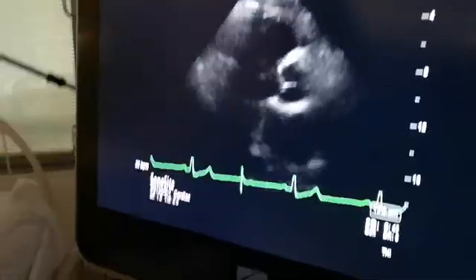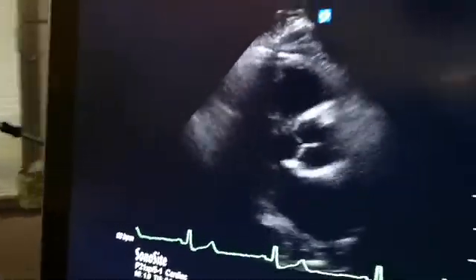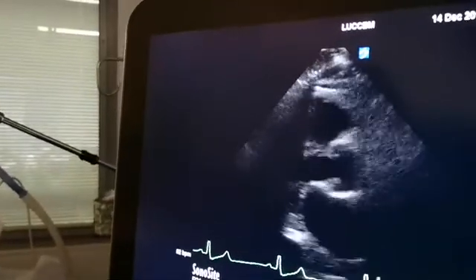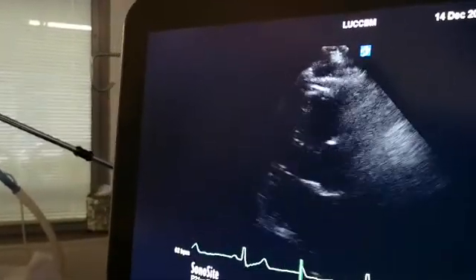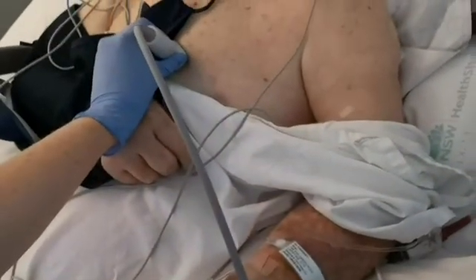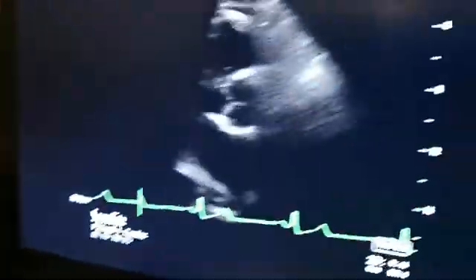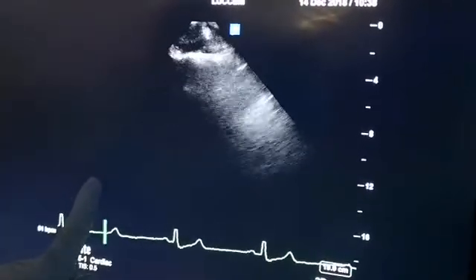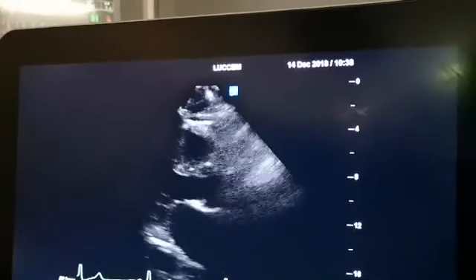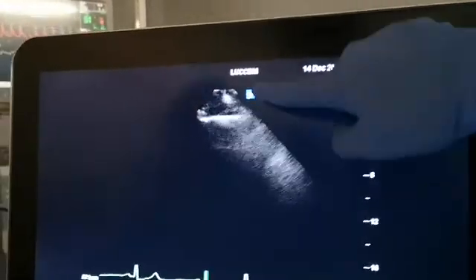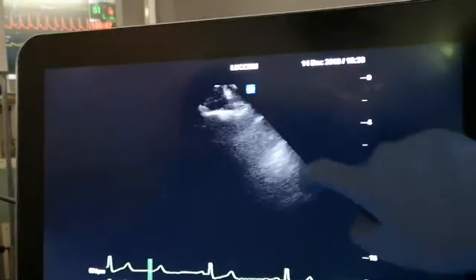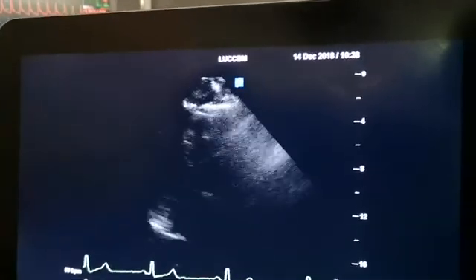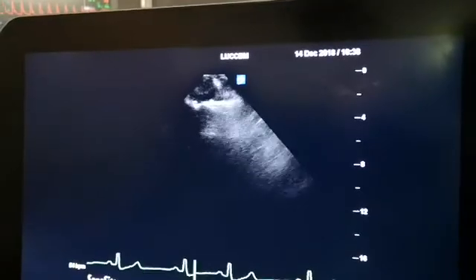So what do you have to do then? Start walking gently towards the probe marker side, which means towards the right shoulder side. Keep going until your probe is only over the heart and the lung here has completely gone. While you're doing that, you may find that the probe marker side is now beginning to show a little bit of lung on the other side.